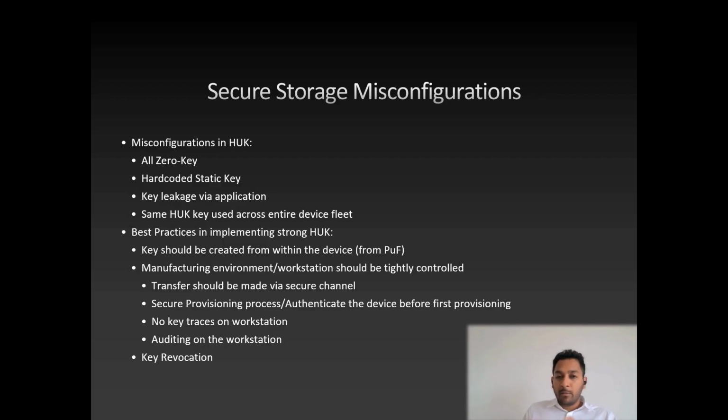Sometimes MPU manufacturers provide this process. You make sure you authenticate the device before putting the key in, to prevent key extraction. It basically leads to another supply chain problem, so you need to authenticate the device before putting the key inside. You need to trust it, otherwise a malicious device will get the key.